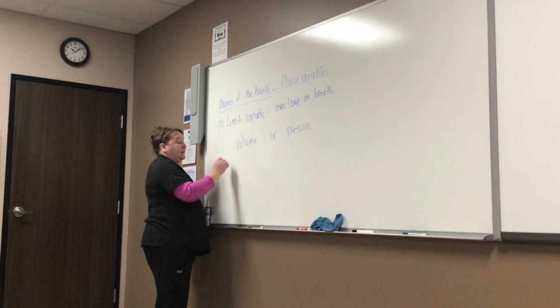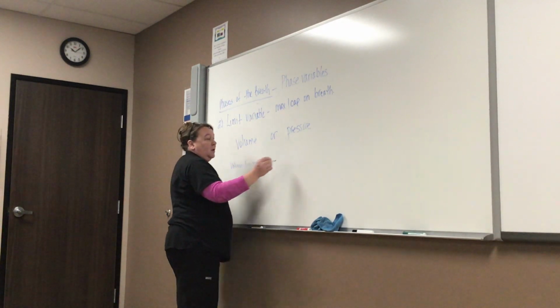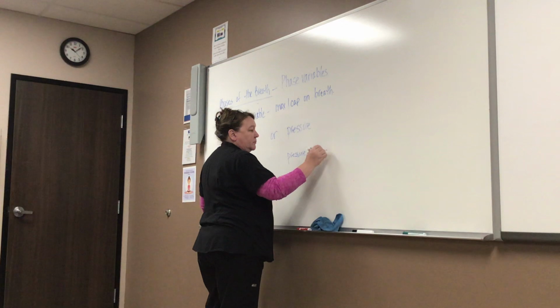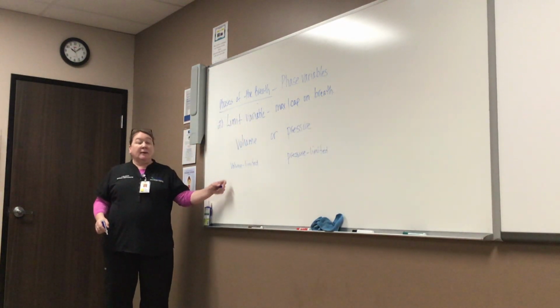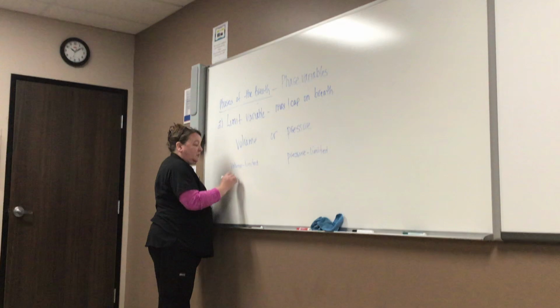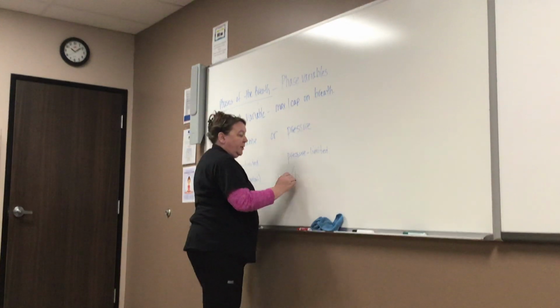So we would say it's volume limited or pressure limited. Another word you're going to hear is volume control and pressure control. Same thing.